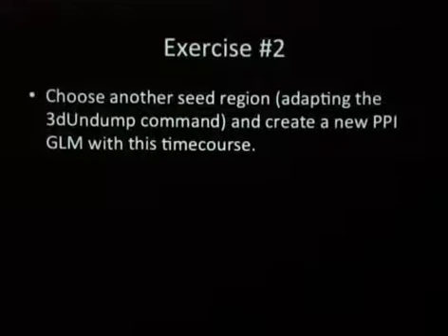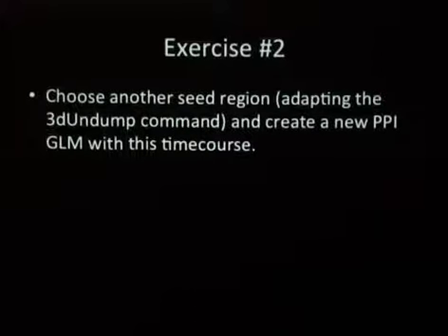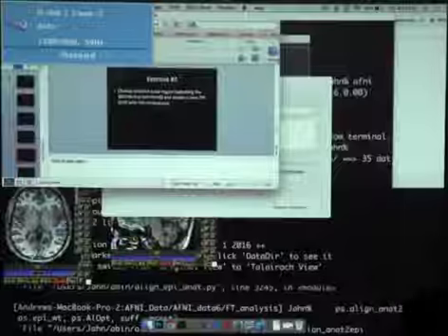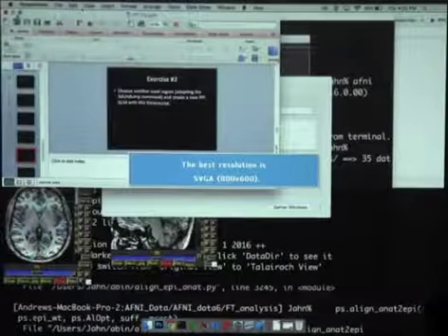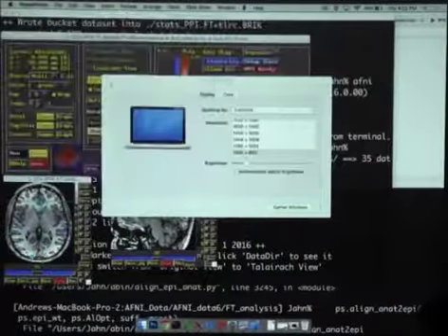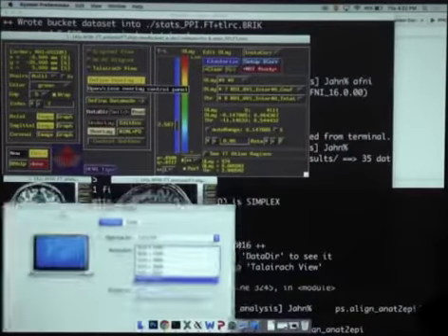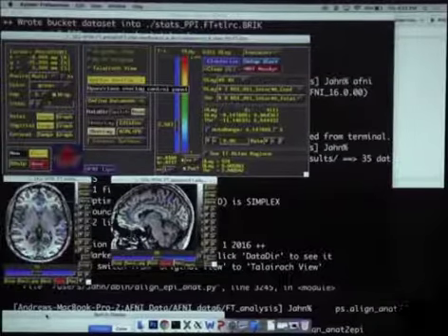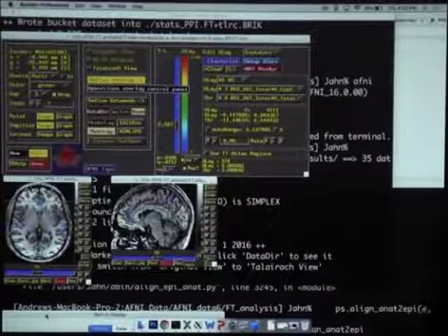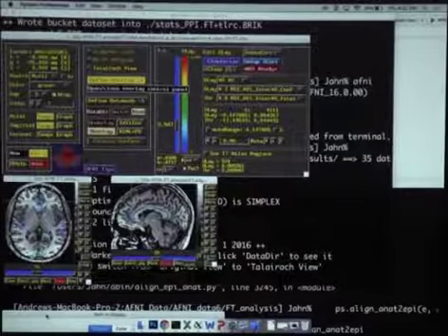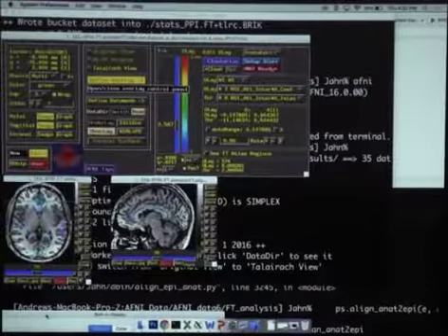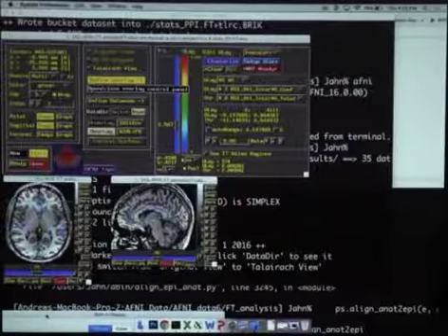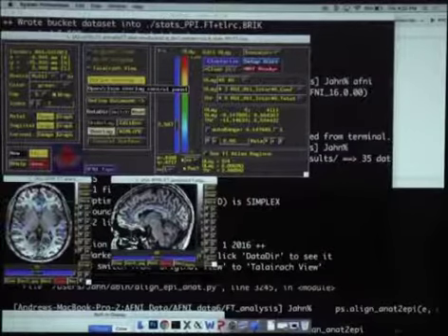Are the coordinates in RAI in the script? Yes. In the ppi_prep script, the coordinates negative 5, 90, negative 10 — I got those by opening AFNI, underlaying the warped anatomical, clicking on the area, and noting those three coordinates. Notice it seems a little backwards: something to the right is actually negative, Y is positive when you'd think it should be negative in Talairach space, and Z is the same in both cases. If you have Talairach coordinates from another paper, usually I'll just flip the signs of X and Y and input that into the 3D_undump command.